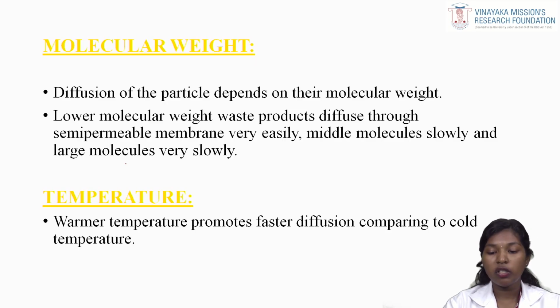Temperature. Warm temperature promotes faster diffusion compared to cold temperature. We have to maintain the proper temperature, which means 34 degrees Celsius, for better clearance. Whether it is warm or cold, it affects the clearance. Certainly it affects the clearance and the diffusion.